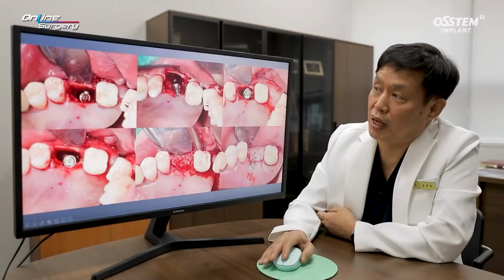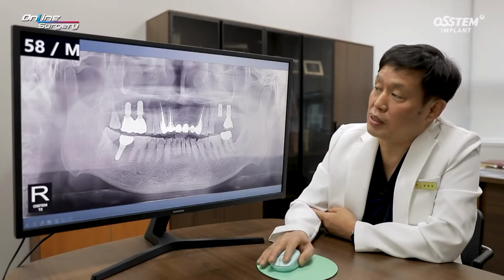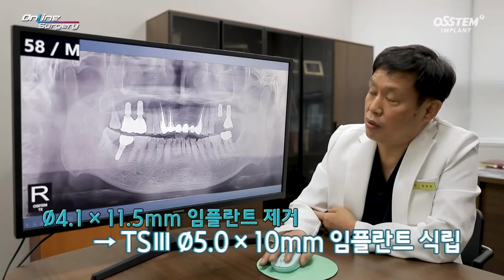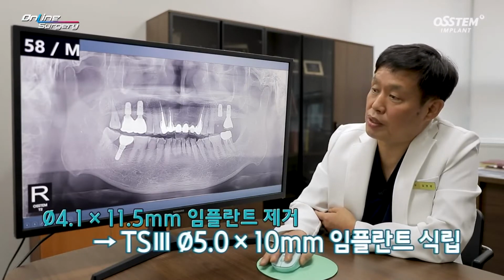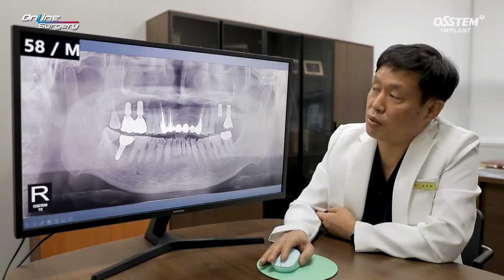This is the post-op image. As you can see, in the area where the implant was removed, the TS3 5.0 by 10mm implant was placed. It was placed slightly deep. The position looks good.